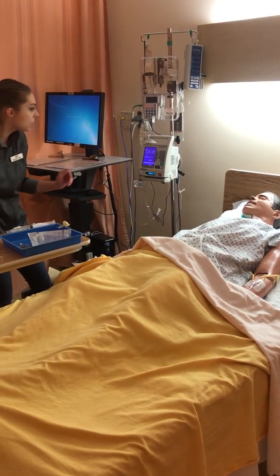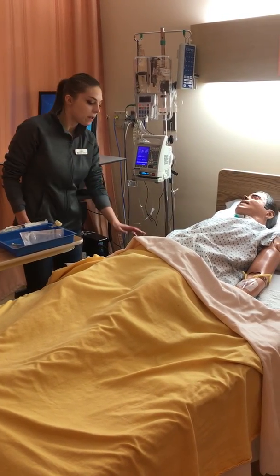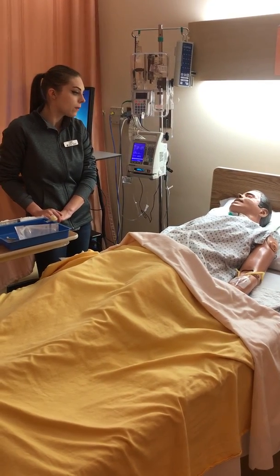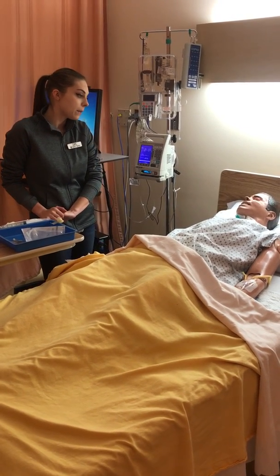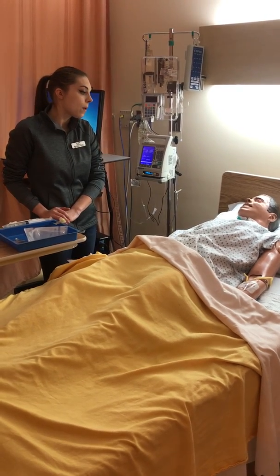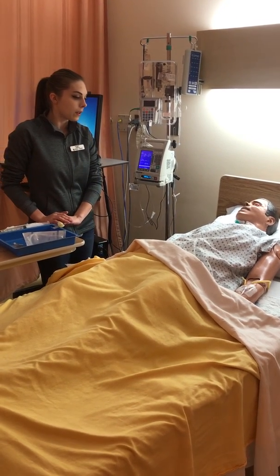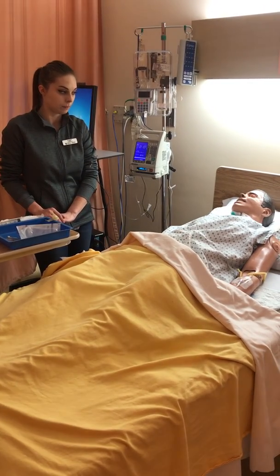I'm also doing a safety check. My pump is running, there are no wires, and his call bell is within reach. So I'm going to educate my patient. I'm here to give you your antibiotic for your chest infection. Some side effects you may experience are nausea, headache, and diarrhea. I'll also be watching for an allergic reaction because this is the first time you're getting this medication. I will give you the right to refuse, and then I will do my third med check at the bedside. Great.